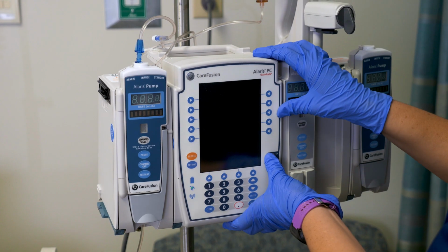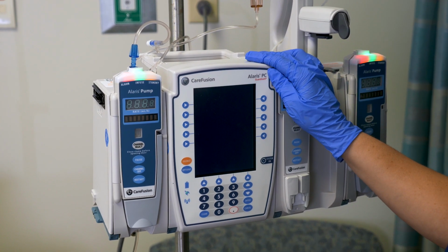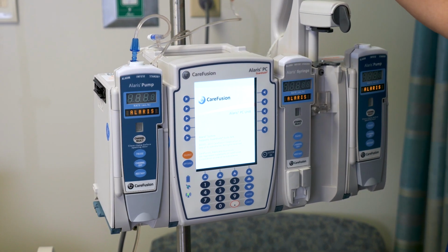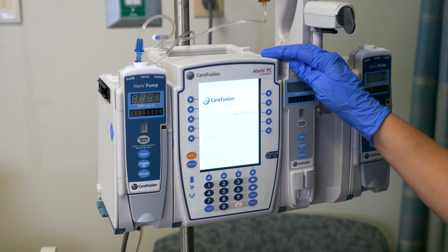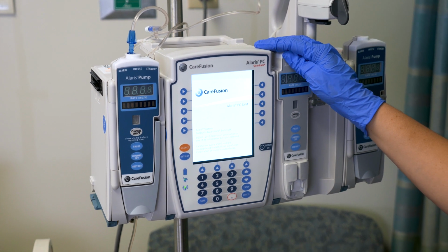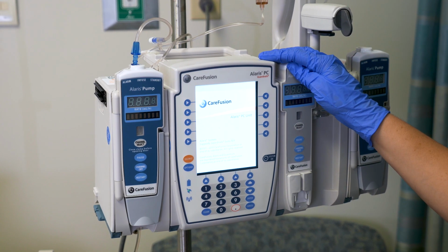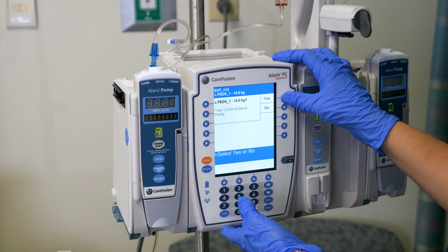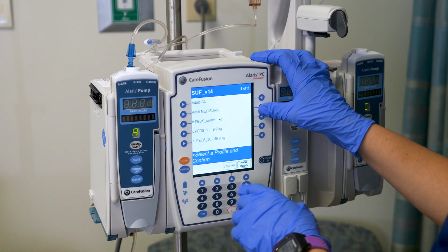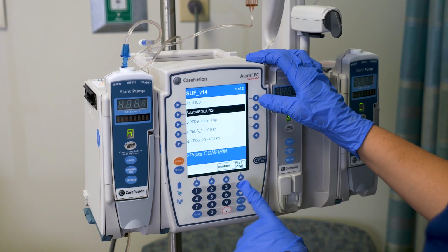I'm going to now set my Alaris pump. My order was for 75 mLs per hour of my normal saline. This is a new patient. We are not on a peds floor, we are on an adult med surg, so you're going to select the correct unit.